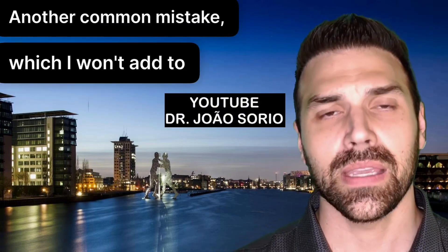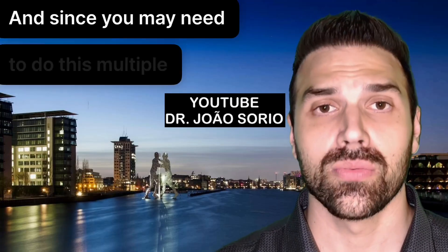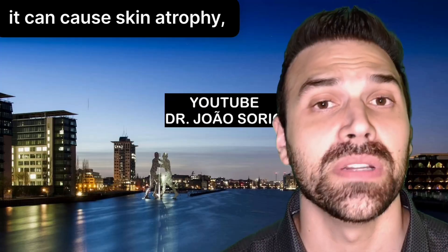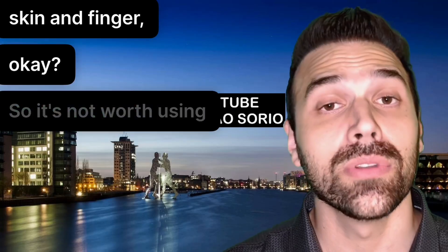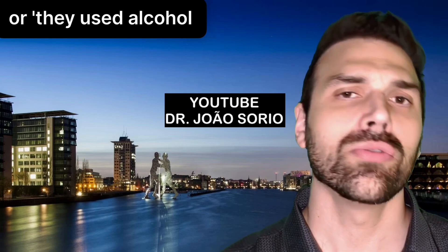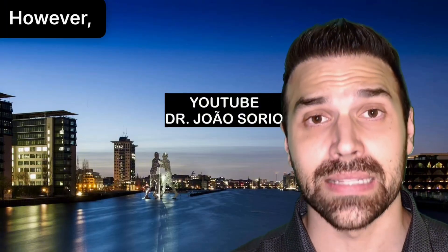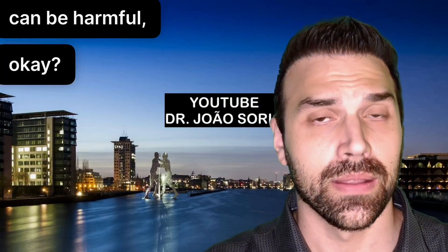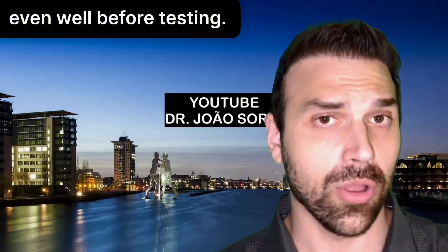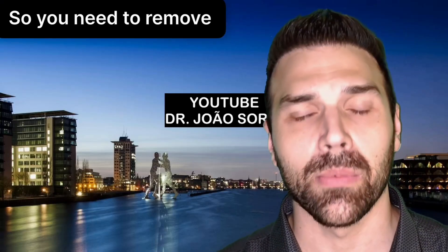Another point worth mentioning is using alcohol instead of washing hands with soap and water. Since you may need to do this multiple times daily, constantly applying alcohol to that area and rubbing can cause skin atrophy and damage your skin and finger. Occasionally you might have only alcohol available, but doing this several times a day at home can be harmful. The real mistake is applying creams to your hands, even well before testing — you need to remove them.